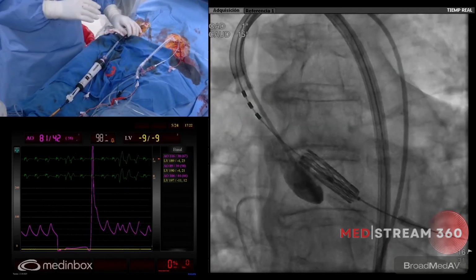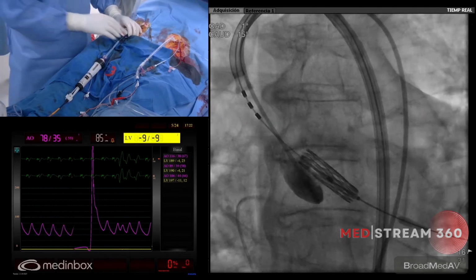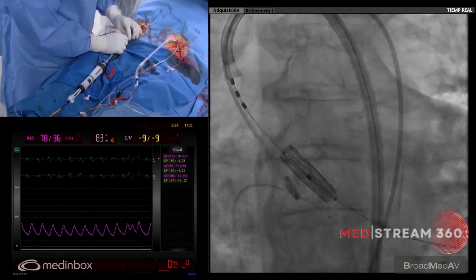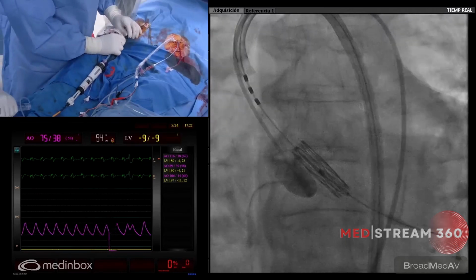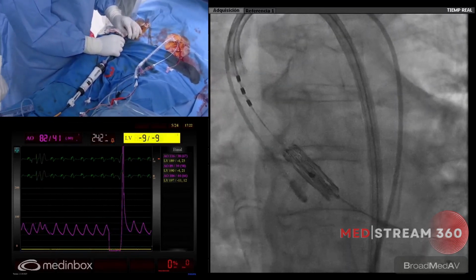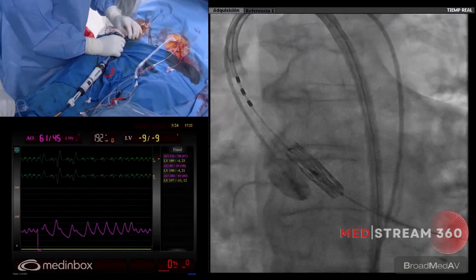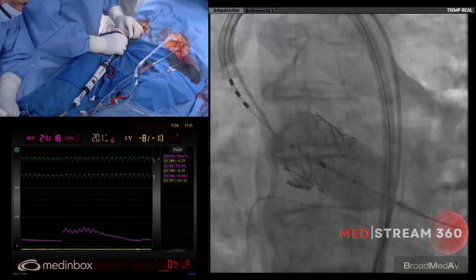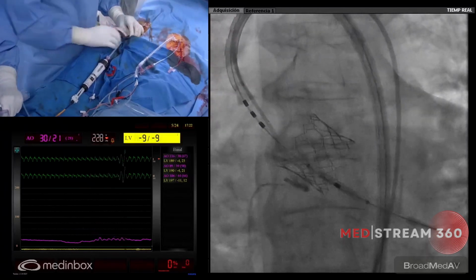We are in the middle of the pigtail with the mark, no? You want a little bit higher? Okay. Okay, probably there. Test. Okay, I will put here. Little bit higher. Okay, so pacing, test. Let's go, Carlos. 1, 2, 3, 4, 5, deflate. Okay.